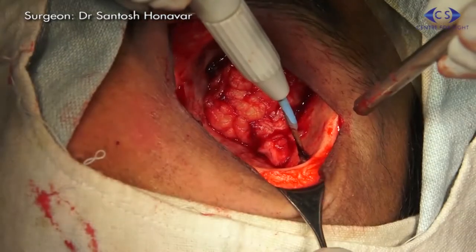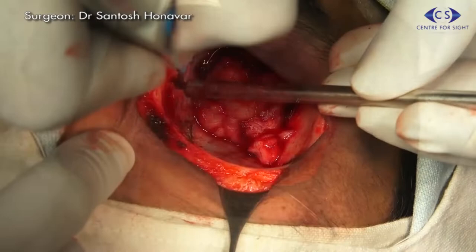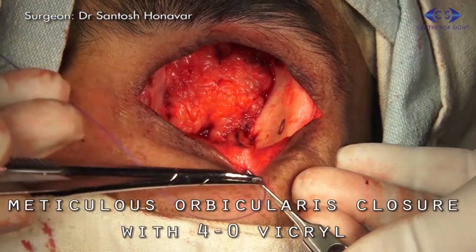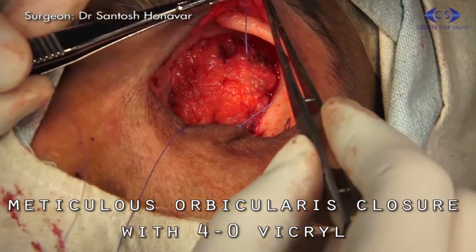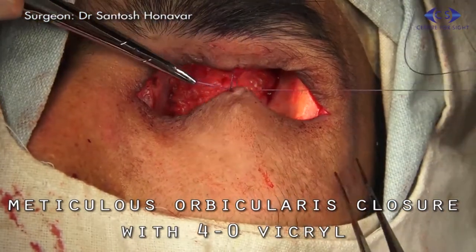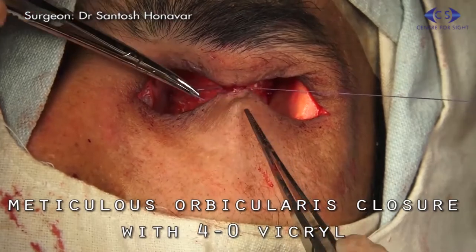The socket is carefully inspected for any residual tumor tissue. The adequacy of resection may be judged with the aid of frozen section control, and resection of additional orbital apical tissue may be required.